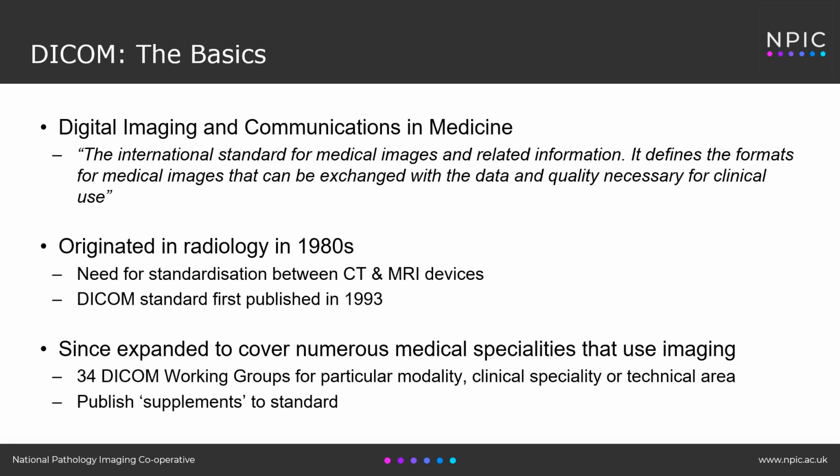In the very early days of digital radiology, imaging devices from different vendors produced proprietary file formats only compatible with their own PACS, that's picture archiving and communication systems, and viewers, which made it practically impossible for radiology departments to replace their PACS with one from a different vendor without also exchanging all of their equipment. The DICOM standard was first published in 1993, and compliance with this standard meant that radiology equipment produced images on a standardized format and communicated with standard protocols.